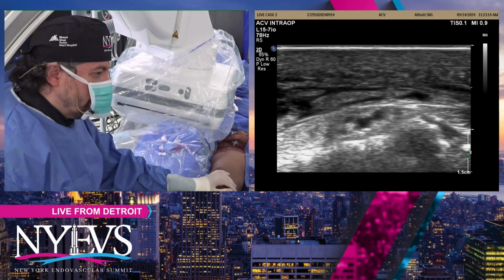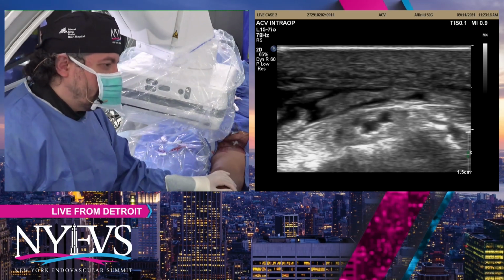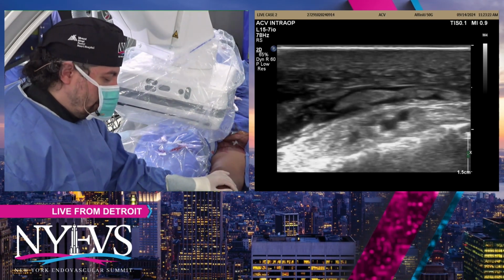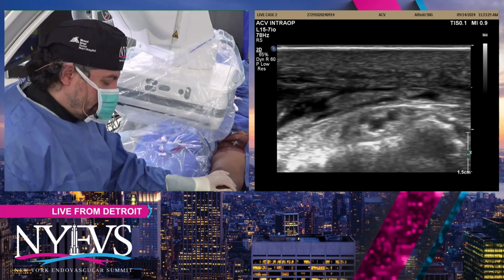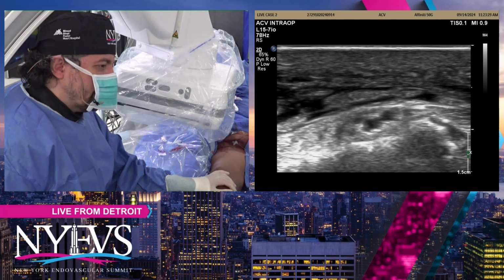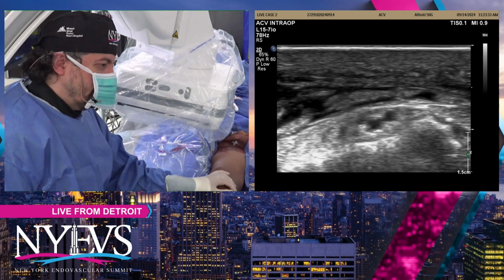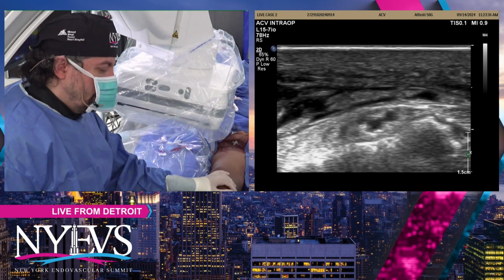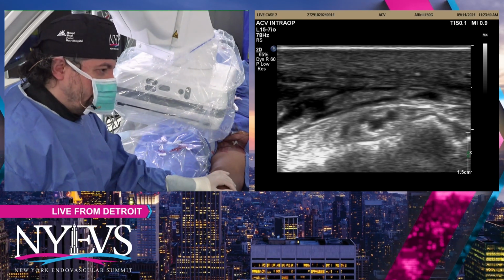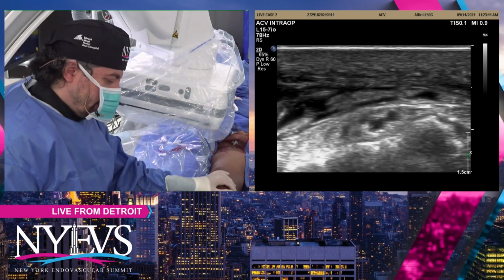And the argument to the administration, to be honest with you, is if you're not able to obtain pedal access, you're not able to perform the procedure. So obviously, I know finances are always part of what administration and physicians think about. So, unless you're successful in the procedure, number one, you're not going to be able to help the patient. You're going to expose them to another procedure. But number two, it's not going to be financially conducive to the institution. So that's how we got some purchase from our institution to support this endeavor.